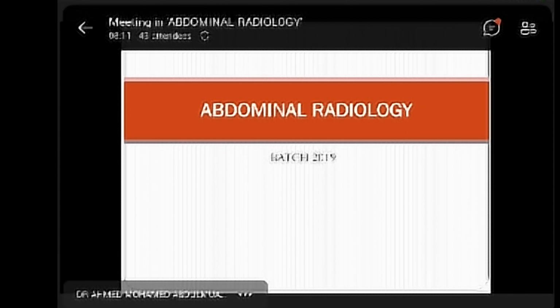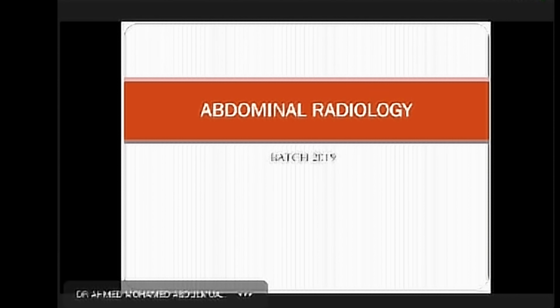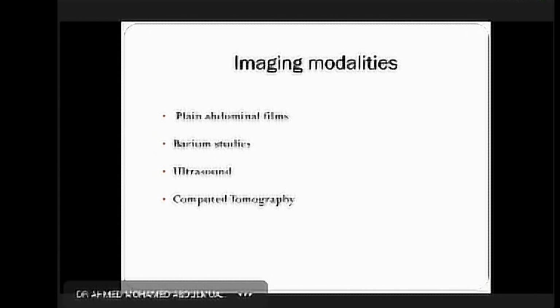Good morning. Today is our abdominal radiology, which is the last common session in radiology. And it is not long, it's a short presentation. These are the imaging modalities commonly used in abdominal pathology, like plain radiograph, which is the least sophisticated modality. We also have barium studies as well as ultrasound and CT scan.